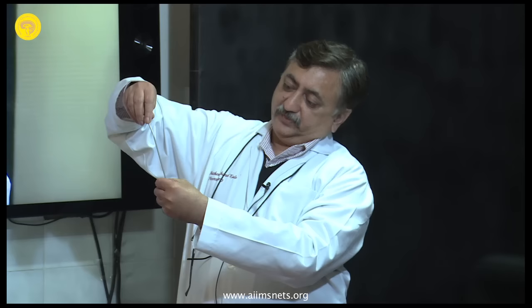But to maintain that intact thing for 2 or 3 months, you need to go a couple of levels above, a couple of levels below. But sometimes you can remove the metal also. After your fracture is healed, you can go back and remove all the screws to get back the mobility of the spine. So if you see the thoracic pedicles, can you see the angle?